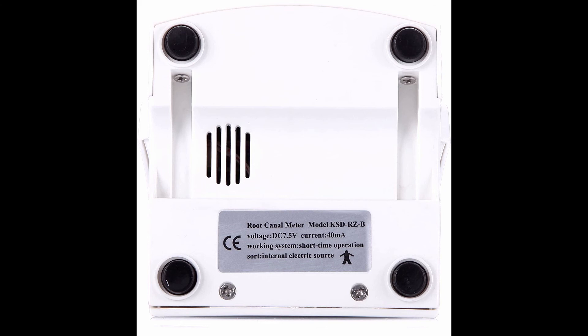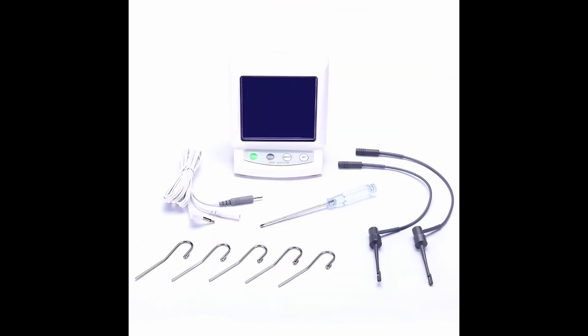Precise measurement results even when filled with NaClO, physiological saline, H₂O₂, water, etc. Irrespective of kinds of teeth, size of root tip, or thickness of root canal file — precise results are maintained.